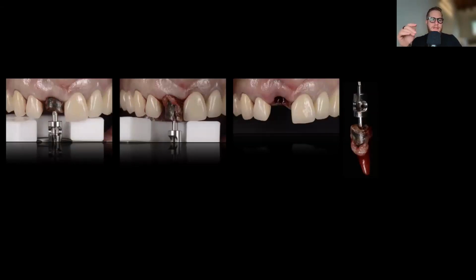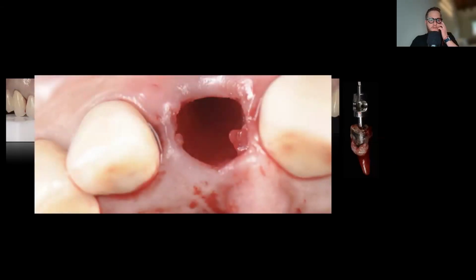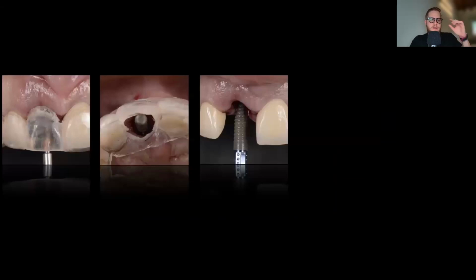Remember that the patient had a lot of structural damage, so you don't have any space to use the forceps. So in this case, we go through the canal, and we're going to be using this special instrument, and it acts as a pulley. So it pulls the tooth in a vertical fashion, kind of like a corkscrew removal. That's the way it works, and it's absolutely amazing, and very, very little trauma to the soft tissue and to the bone. So we like to use this system. I suggest you try it if you want to experience it.